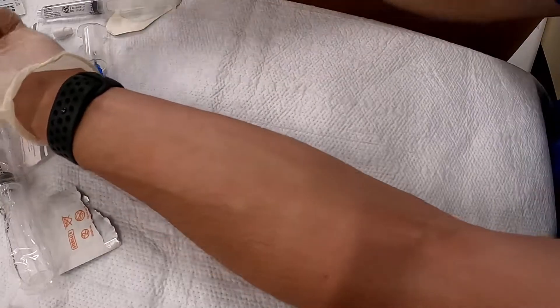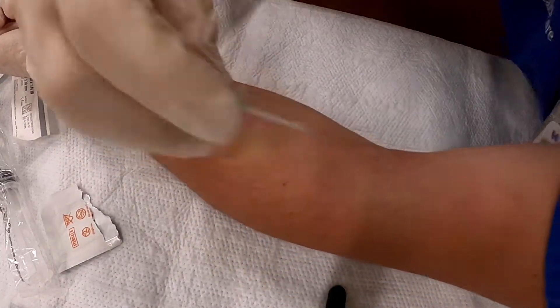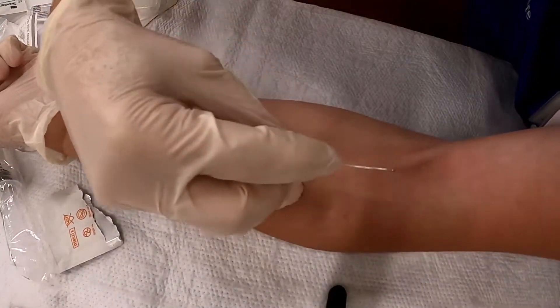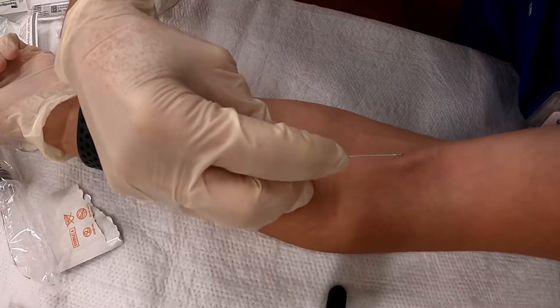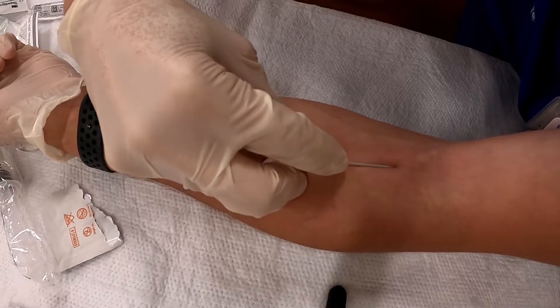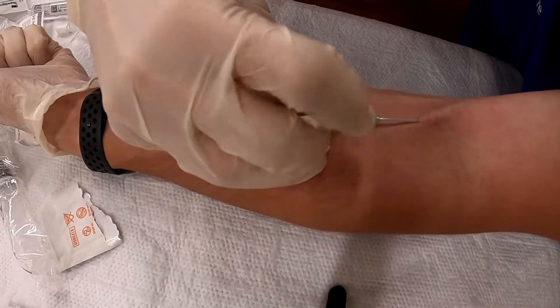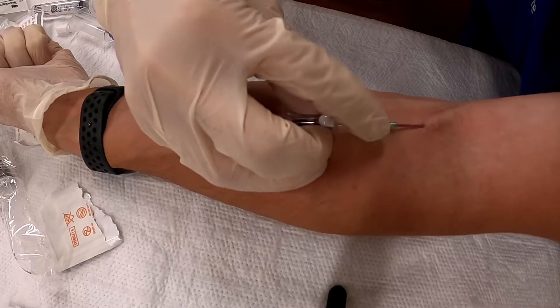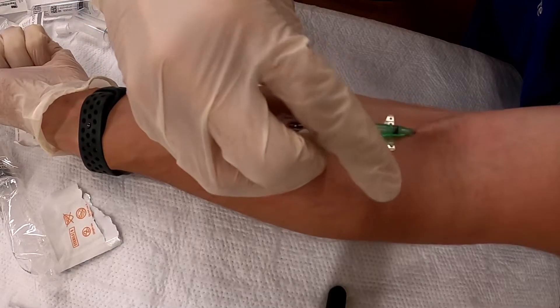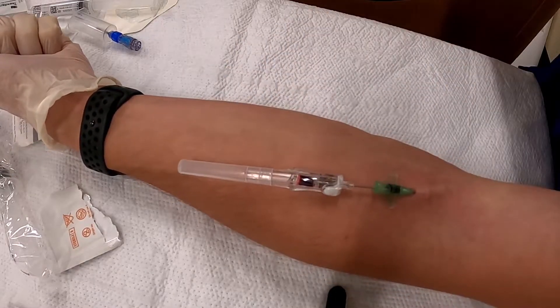Everybody see us? Jacob, you'll have to say something so that the camera goes back on you. I'm here, I'm still here with you folks. I'm gonna pop the tourniquet.